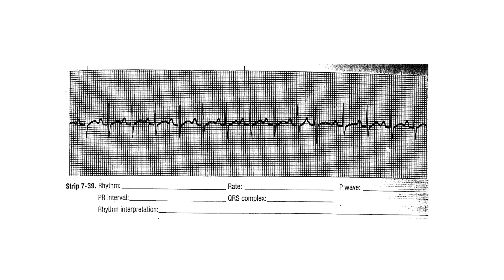In 7.39, this patient is regular with a heart rate of 136. There are P waves before each QRS. The PR interval is 0.16 to 0.20 - measured right before the P to right before the QRS. The QRS is 0.06 to 0.08, normal, coming from the SA node. Because the heart rate is greater than 100, this is sinus tachycardia with one PAC.